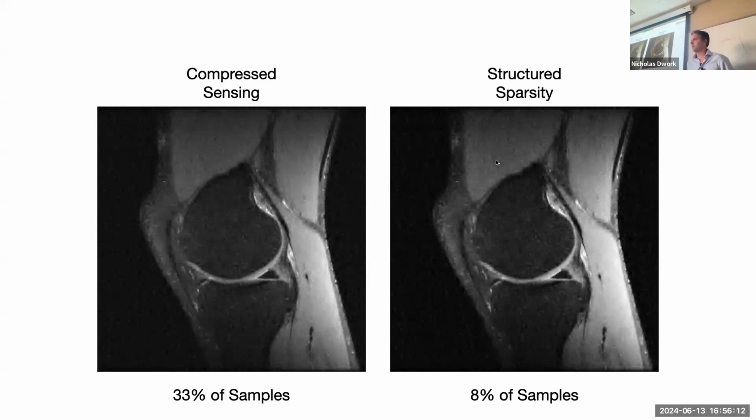Although I see the individual wavelet pieces, I don't see the block boundaries I might have expected from the transform. It's orthogonal. It's the Daubechies discrete wavelet transform of size 4. I don't usually see that.